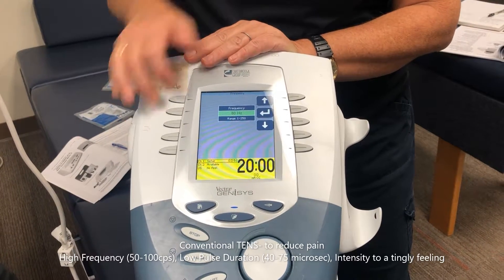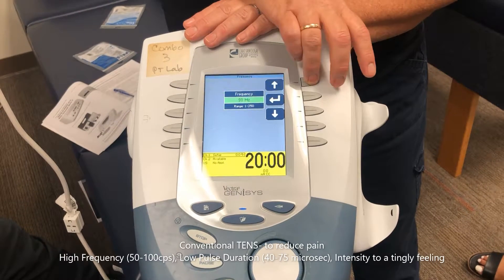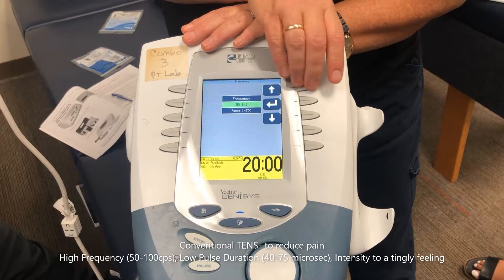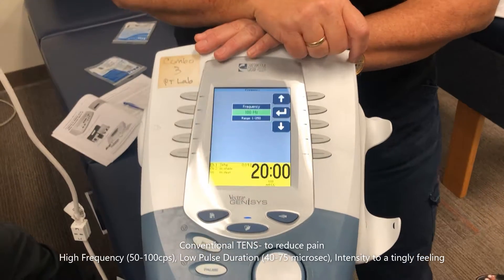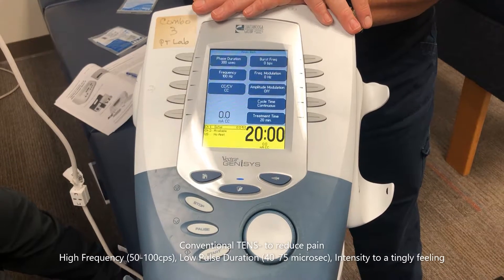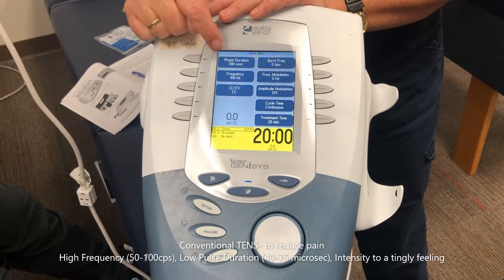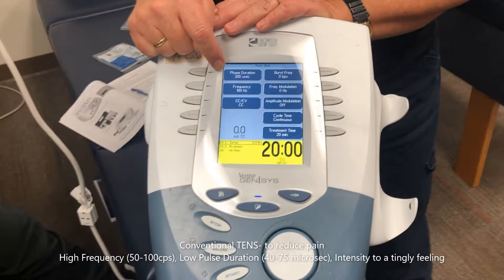I could have left the frequency at 80, but I basically always tend to pick the highest frequency in a given range — that's just my approach. Now, what's phase duration? Another way to say it is pulse width or pulse duration.